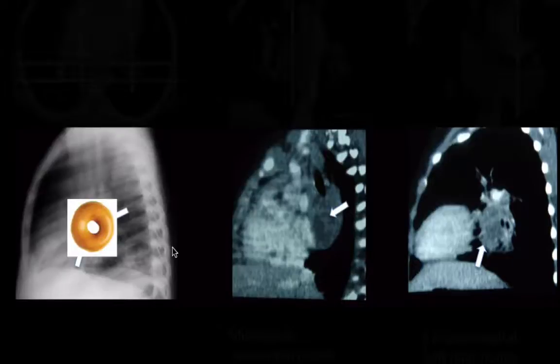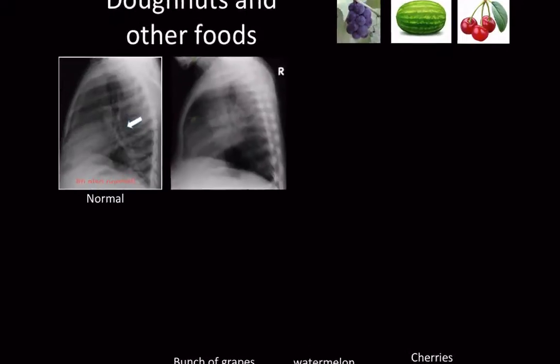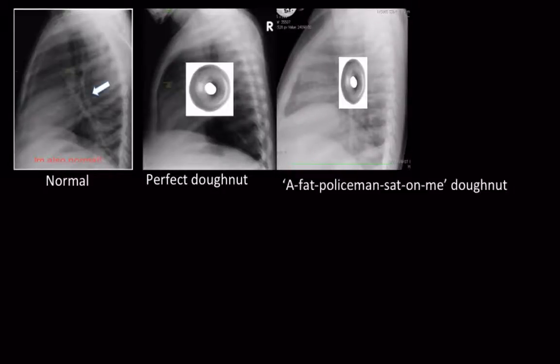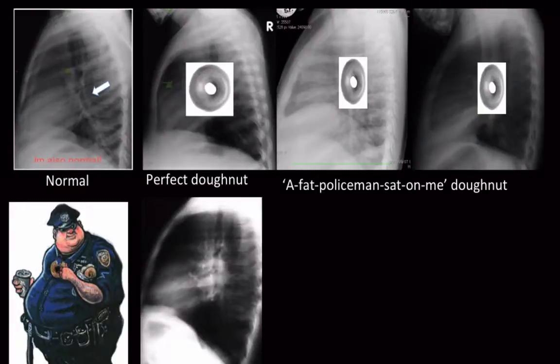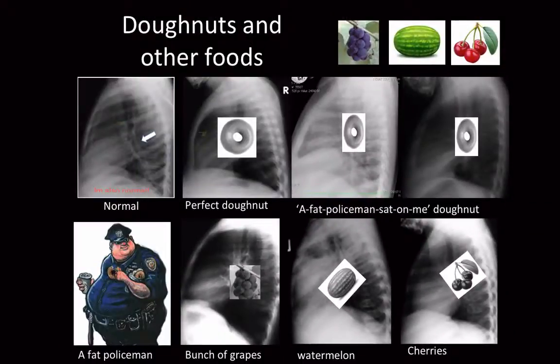If you look back at your lateral chest radiograph you'll see how these two lumps of lymphadenopathy make up your oval donut sign — it's pretty easy, there's your donut. Of course, not everything is a perfect donut; sometimes it looks like a bunch of grapes, maybe a watermelon, maybe a bunch of cherries. It's just to show you that if you're comfortable with where the normal blood vessels should be and you see soft-tissue-dense lumps below this, then you can call lymphadenopathy.